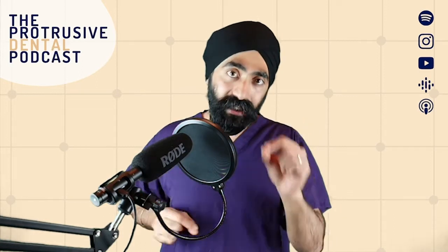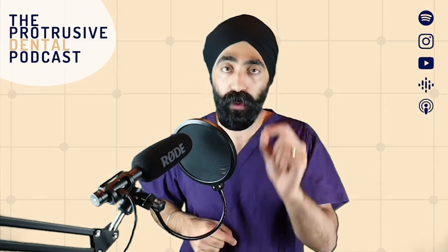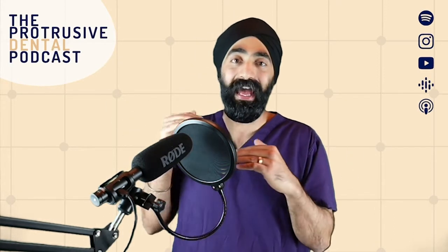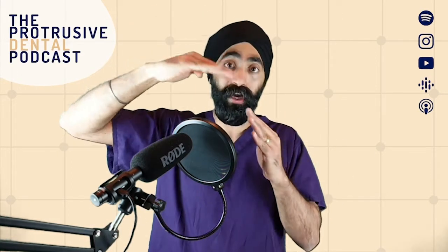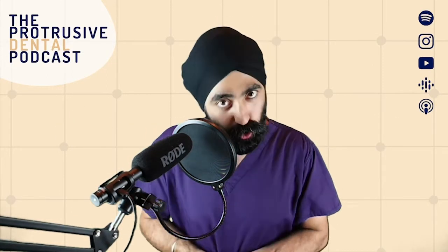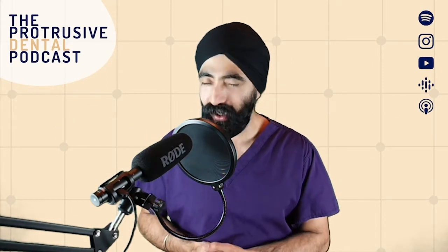So just to summarize, when you're taking your bite record, consider taking it at your desired vertical dimension and not at an arbitrary position, because your technician will not have to raise the pin or open the pin on the articulator, and therefore you reduce another layer of error. Anyway, I'll stop babbling. Hope you enjoy that, Pearl, and I'll catch you in the outro after this stonker with Salman.